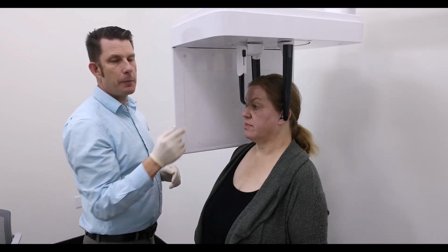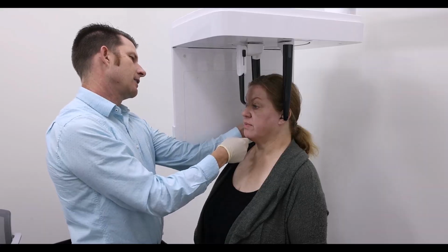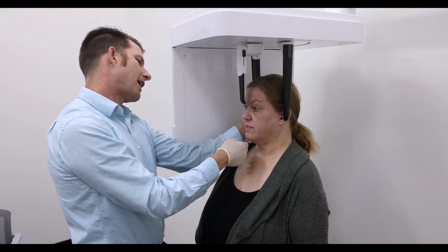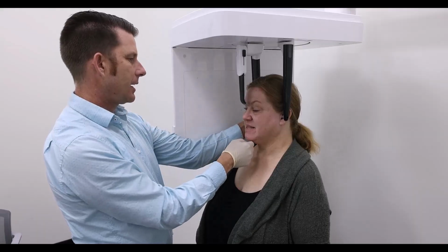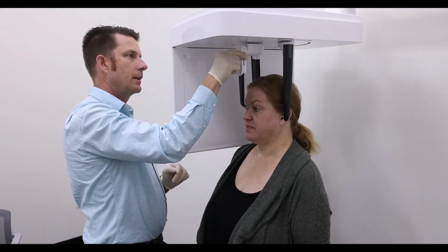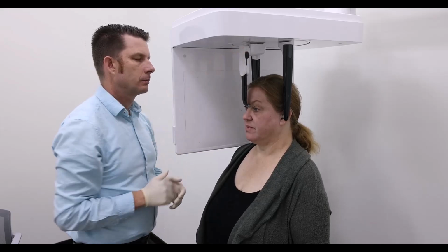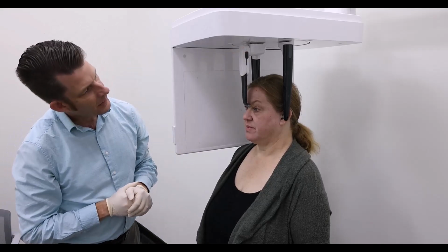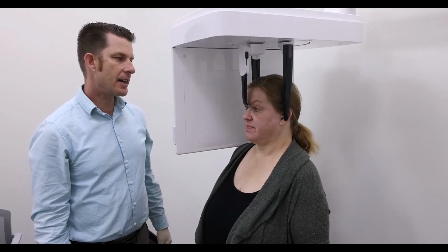We are looking to have the patient in a natural head position, so what I want to do is have my patient gently tip your head down, smile for me, and I'll go ahead and open the smile, and I'm looking at her occlusion. Okay, you can go ahead and relax. And I'm going to move this down, and we're going to go ahead and put this just like so. You can see that our patient is standing up straight, arms to their side.